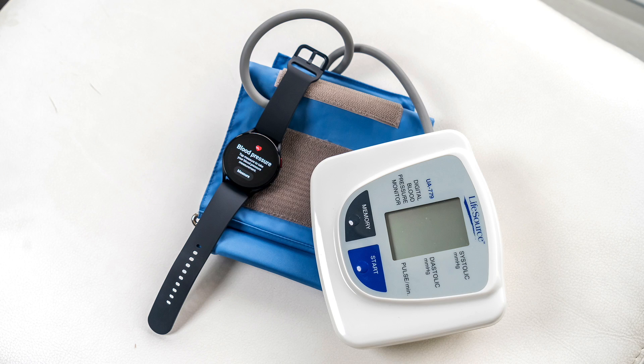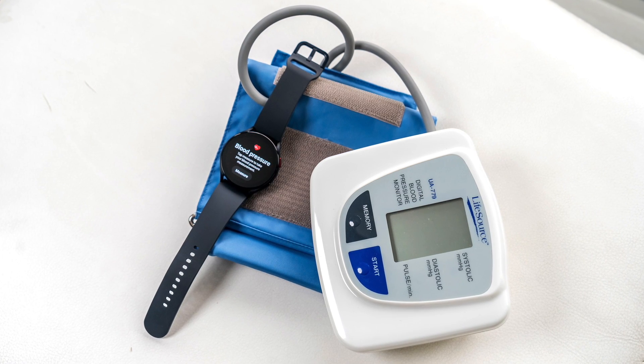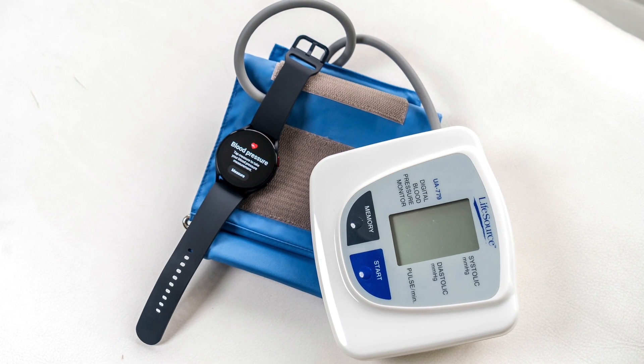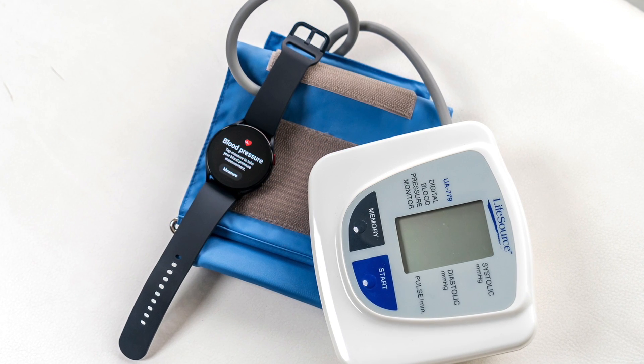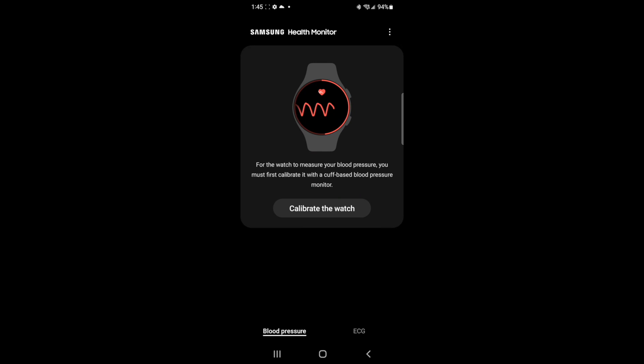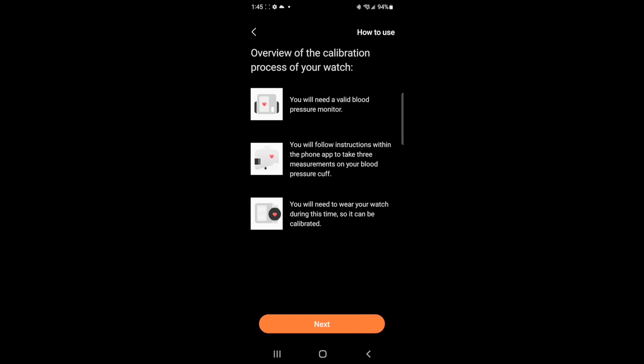When it comes to the blood pressure monitor, you do need a little more setup. You'll need an actual blood pressure monitor — the one that you cuff around your arm — at least to set it up. It has to be on the opposite arm from whichever you're wearing the watch. So if you're wearing the watch on your left arm, you have to put the blood pressure monitor on the right. The idea is that when set up, the watch recognizes that a blood pressure reading is taking place and will have you do it three times, where it then calibrates so it can do it on its own.